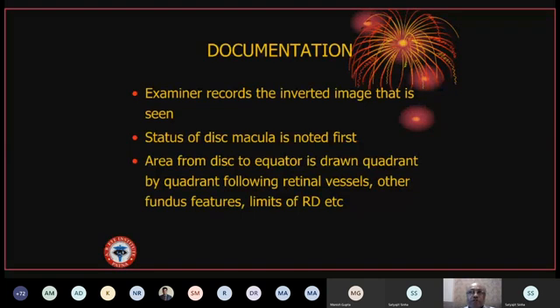If it is a couch, which is what we mostly have nowadays in our OPDs, the patient sits on the couch with the seat up in front, then you move the seat-up away and the patient lies down backward, or you have an examination table and you go all around it. So there is no question of the diametric opposite being inaccessible; it will be accessible. If you are seeing supratemporally of the right eye, you are standing on the left side of the patient, a little on the lower part, near the patient's left shoulder. I repeat myself again, if you want to examine the right eye supratemporally, you should stand on the left side of the patient, a little bit near the shoulder, with the patient looking up and out with the right eye, and you standing right on the opposite side.